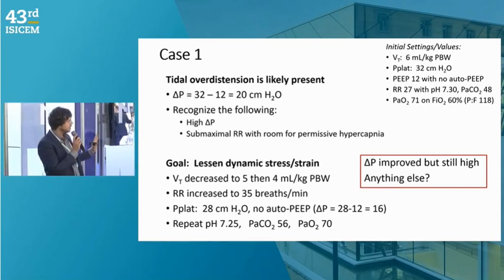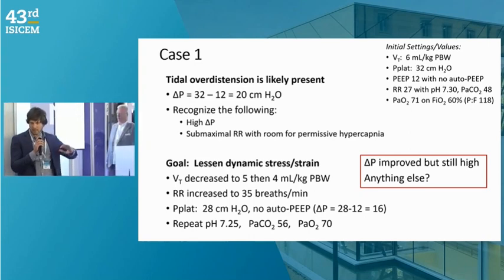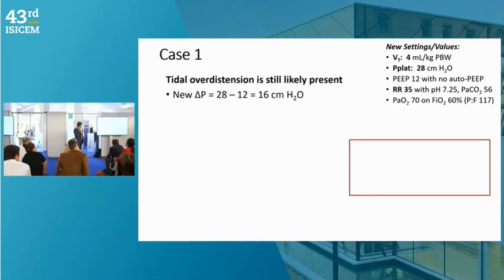So I think we've made progress because we haven't contributed to, if the patient were now desaturating and had a PO2 of 45, then of course this isn't the right thing. But since that was relatively constant and we improved the mechanics, I think this is a step forward. So where would we go from here? Just in the interest of time.